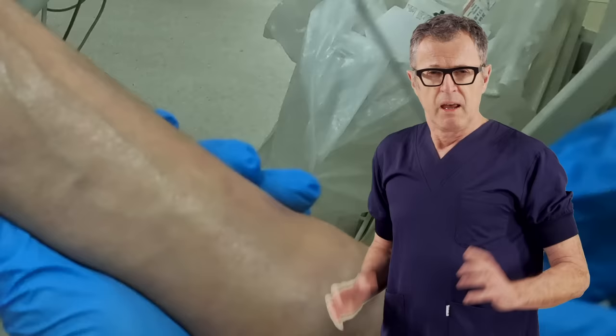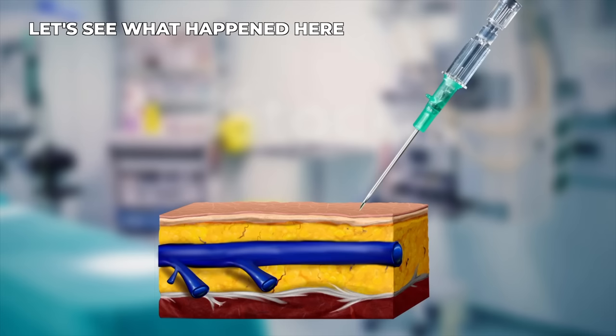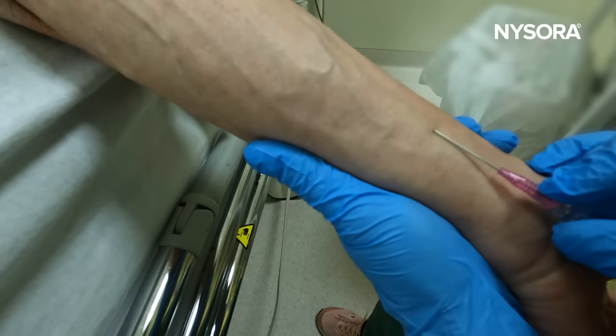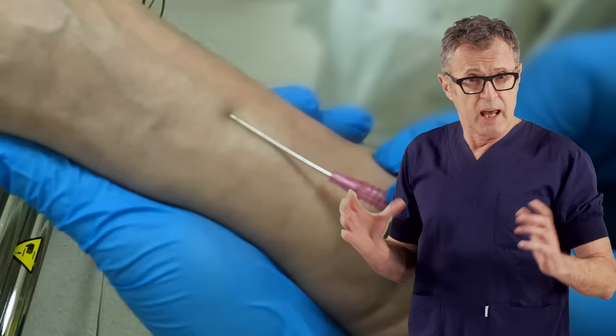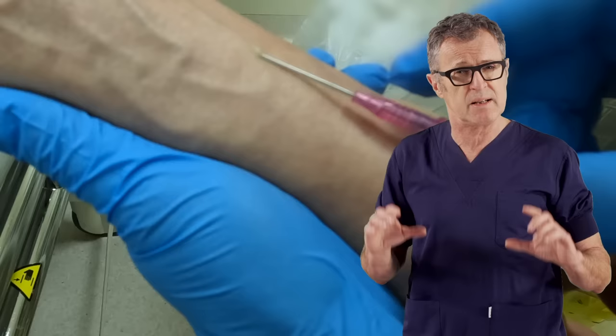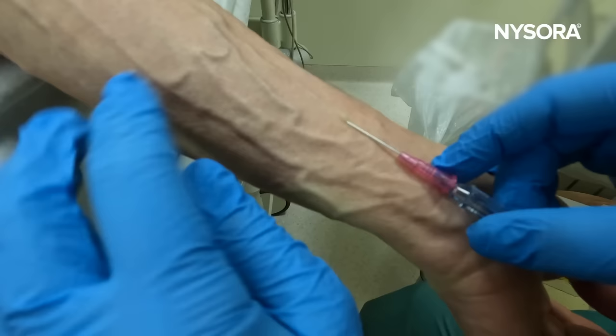However, the needle entry at this attempt was too slow and the vein rolled away, resulting in needle placement beside and underneath the vein with no access to the lumen. As you can see, the needle is sufficiently deeply inserted into the skin and the vein is very superficial, which means that the operator has missed the vein — the vein rolled away — or the needle is underneath the vein. There is simply no chance the needle catheter will enter the vein, so you need to go back.